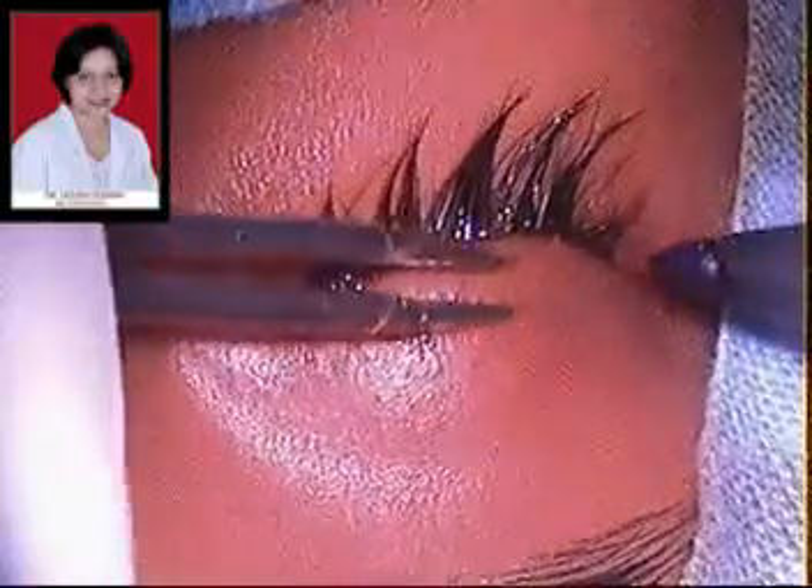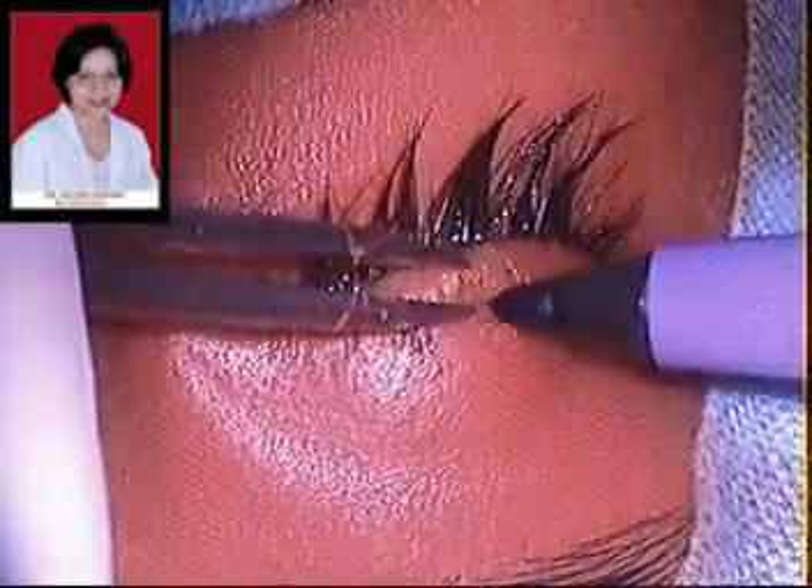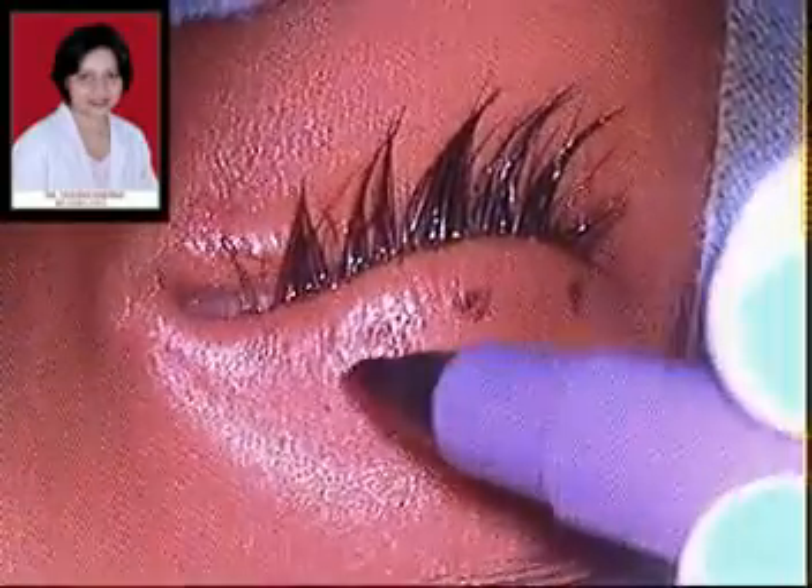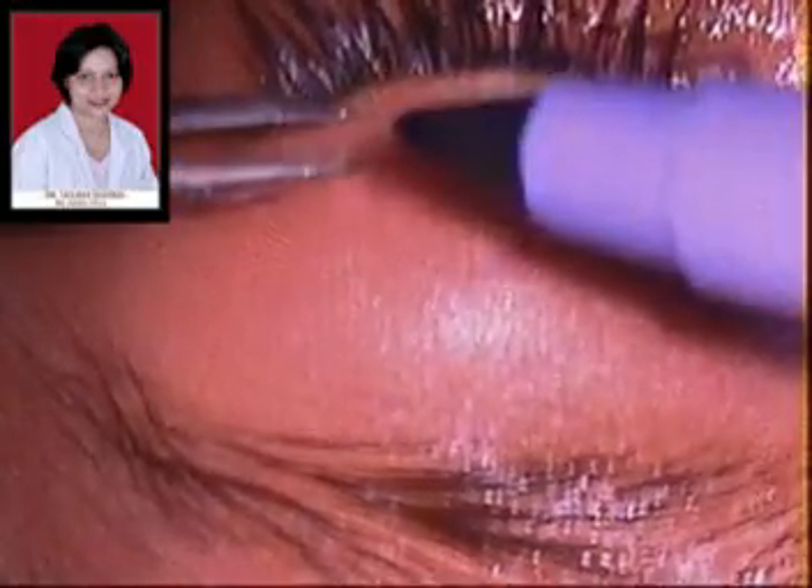Now these are the skin incisions being marked before performing the surgery. Three lid incisions are marked about 3 mm above the lid margin. There is a trend now to make these incisions closer to the lid crease.